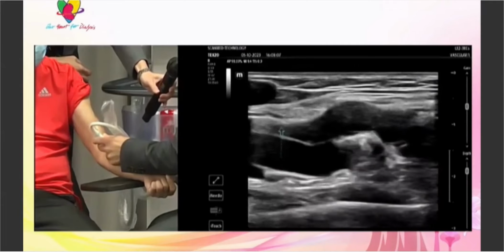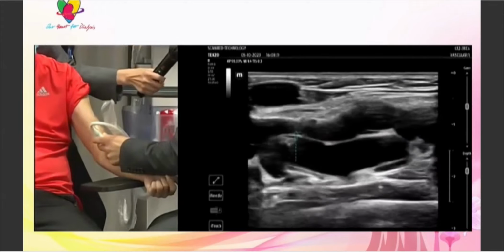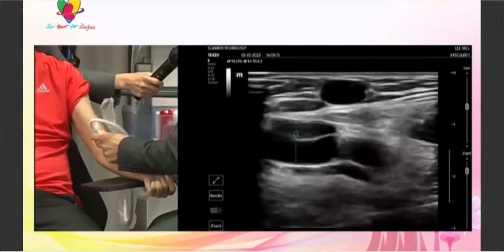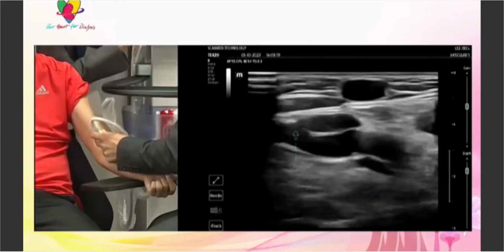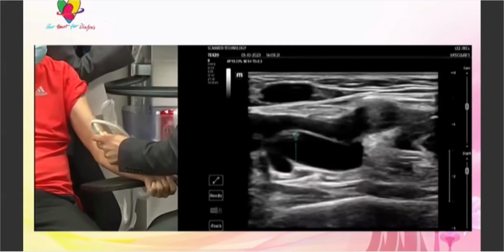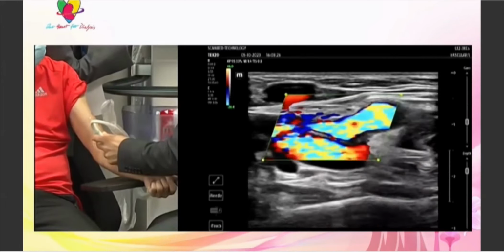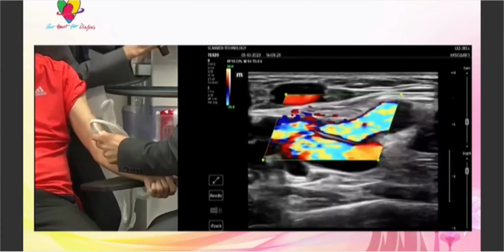Then there is probably non-significant narrowing because his flow is 1.8 liters. And then it goes towards the brachial vein, which was probably coiled. Just one interruption. This previously had a stenosis, so we did an angioplasty 3 months ago. So I think it probably has a little bit of narrowing back, but the flow is very good.